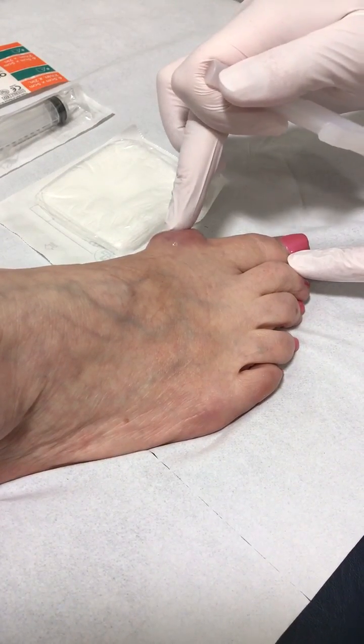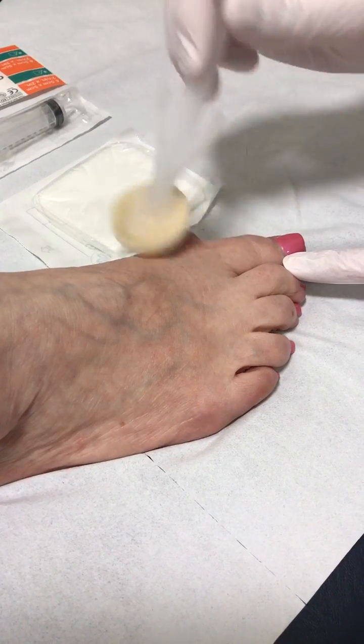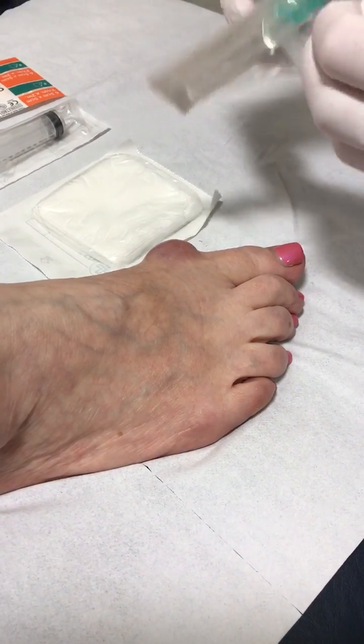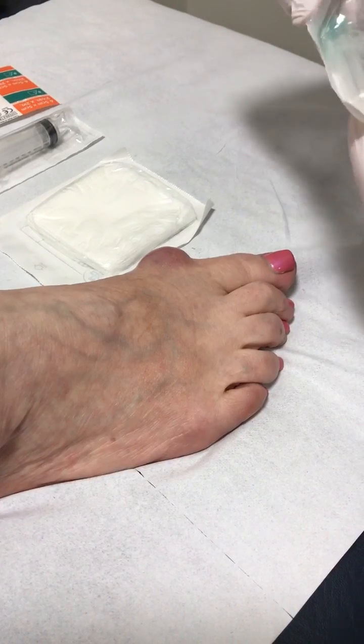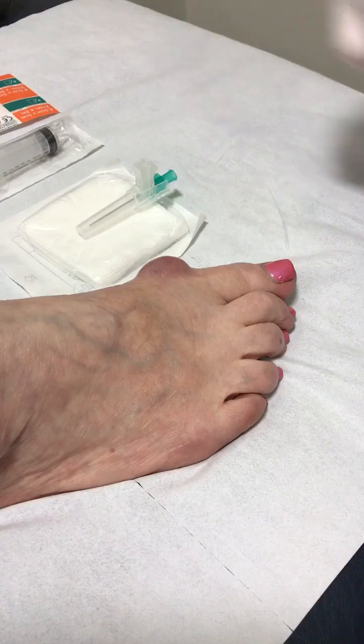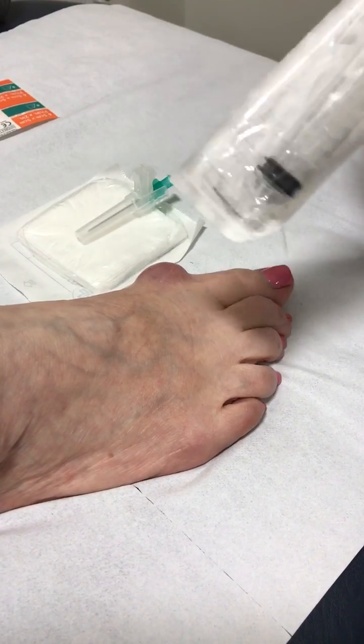There's a little bony bump just there — you're feeling that? Just a little bit subtle, it doesn't disturb me in any way. But some shoes are in use, aren't they? Yes, so we'll take a green needle and a nice big syringe out of the packet.